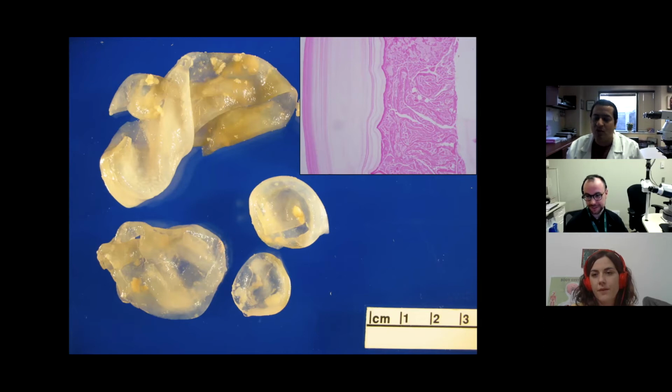I never had that here. This in the lung? Never had an example in the lung of that. Yeah. I saw it in the liver, Irene? In the liver. You do? I saw it once in the liver. Hydatid disease?